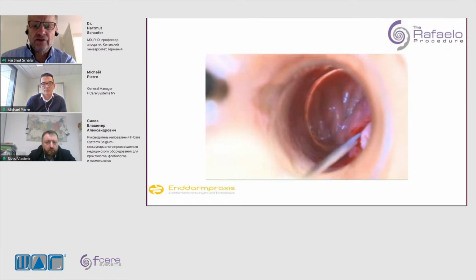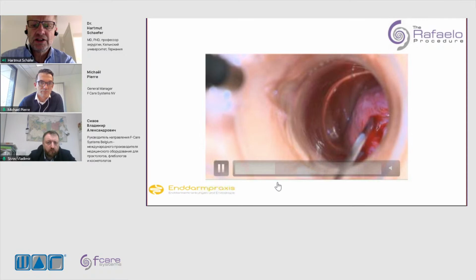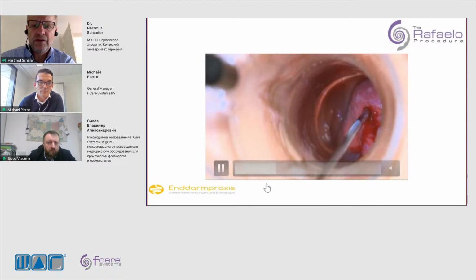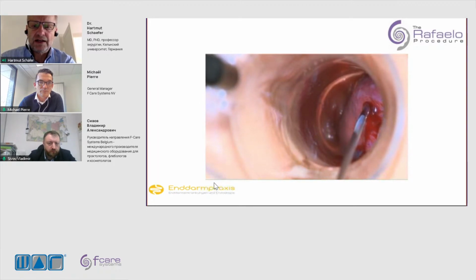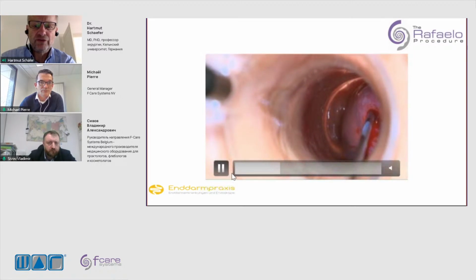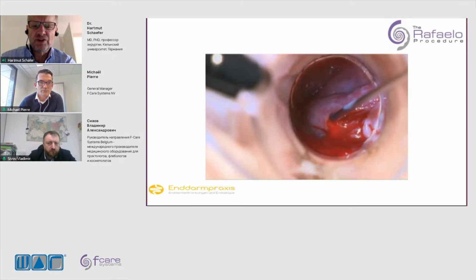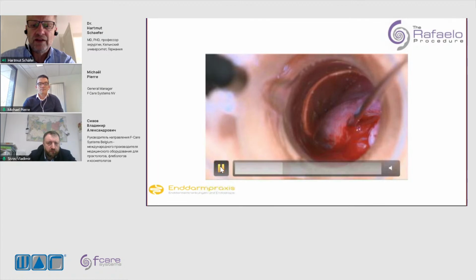So now follows through the same hole the introduction of the hand probe for radio frequency application, and you see that we go forward with the tip up to the place where we prospect the arteria, and then we give the energy. What you can see here, hopefully, is the whitening of the surface, and the giving of the energy. And the next step is very important. You change the position to the other margin of the hemorrhoid in order to coagulate all the hemorrhoid.